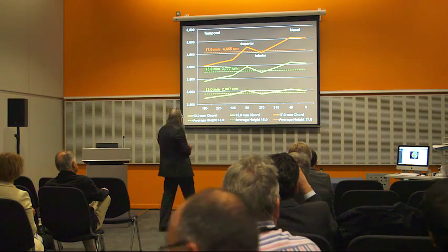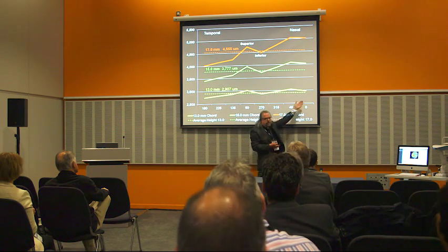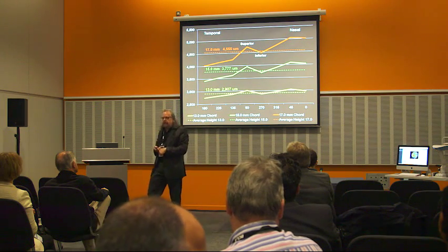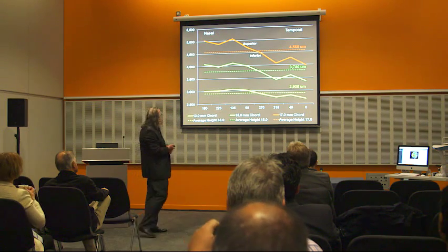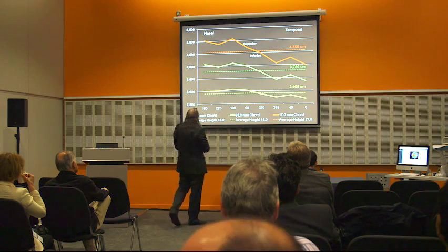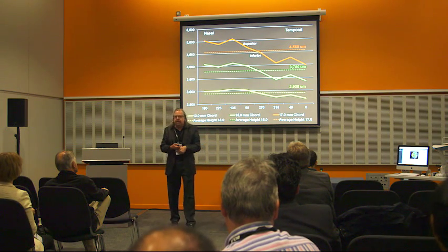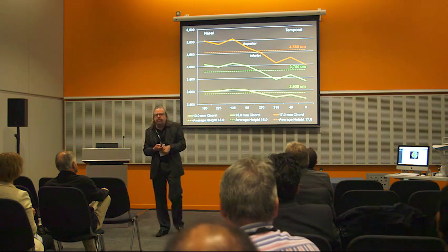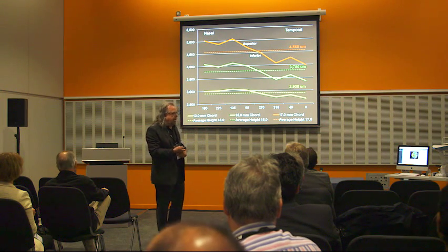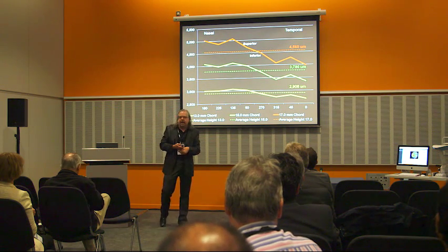That is, there's very little asymmetry here at 13 millimeters. However, at 17, it dramatically increases. Now, that's data on the right eye. Here is the data on the left eye. As you can see, a very similar distribution of the height of the sclera, being significantly higher on the nasal side versus the temporal side.